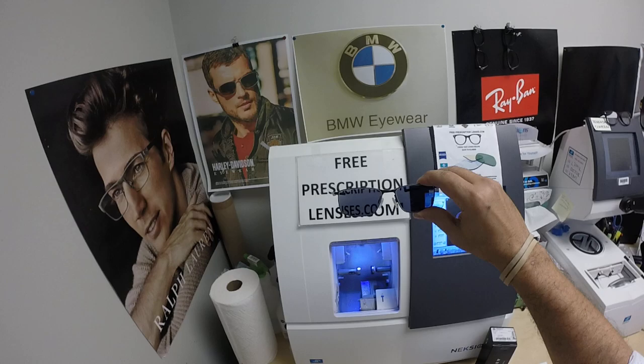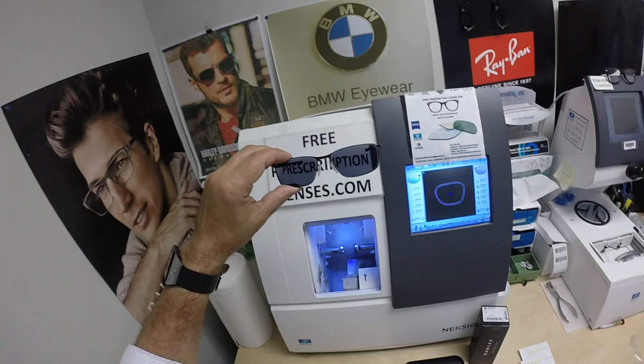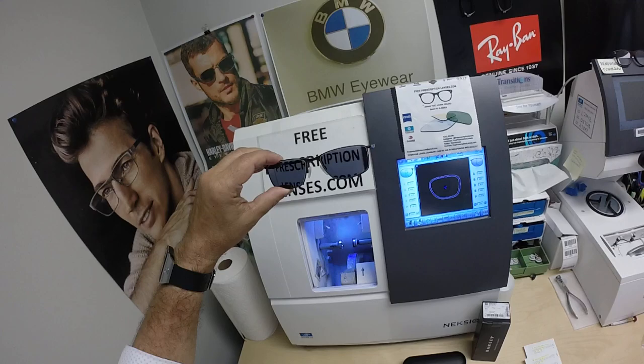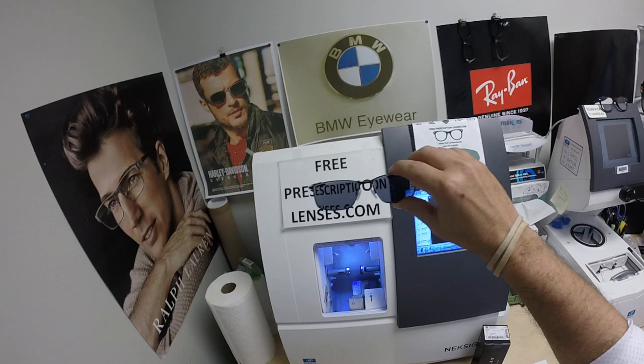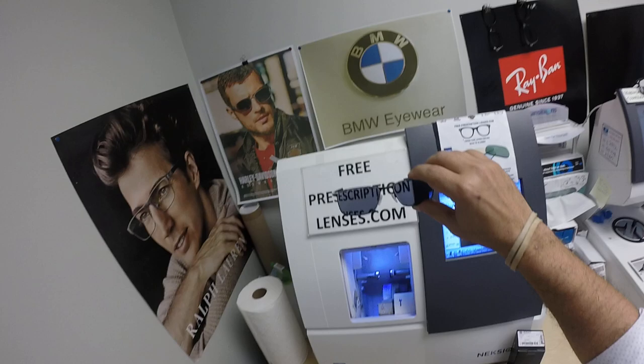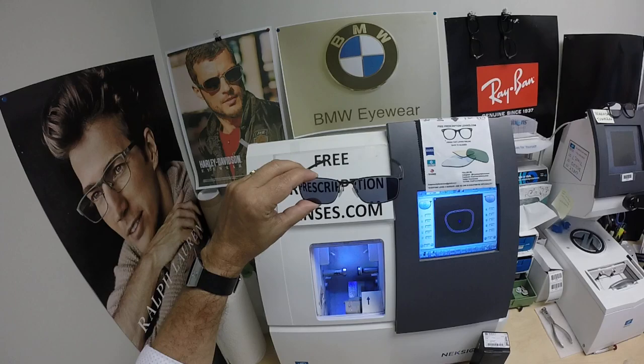These Zeiss Photo Fusion Extra Dark Gray are designed for extra active people who spend extra amounts of time outside, and they will get darker in hotter weather. I'm saying this as the west is experiencing extreme drought and heat — up to 130 degrees in certain places, 115 degrees in Phoenix, and 99 degrees in Denver for the last couple of days. These also have 50 to 70 percent harmful blue light protection, compared to 30 to 50 percent for the regular Photo Fusion lenses.